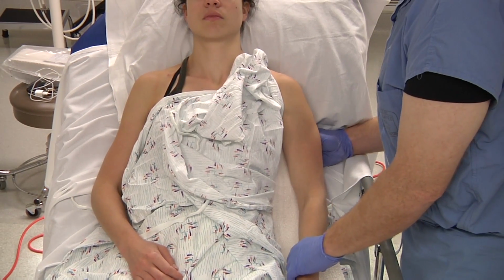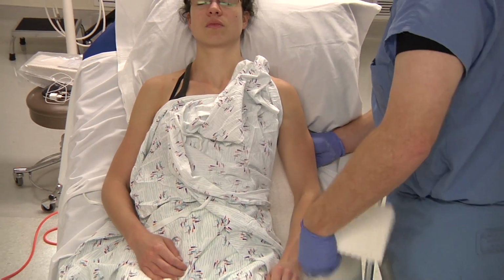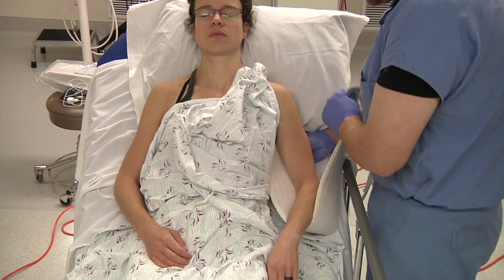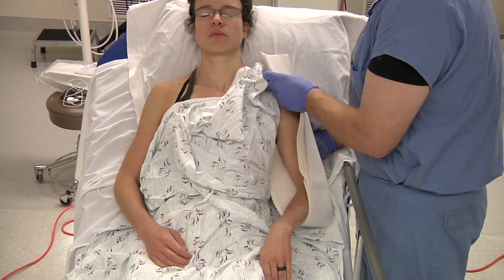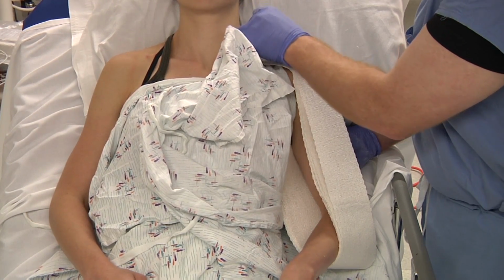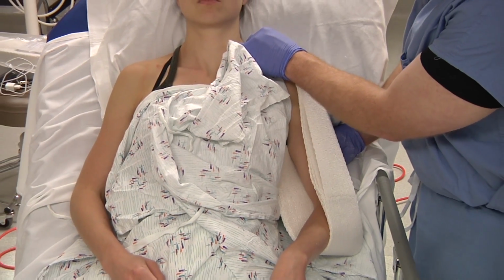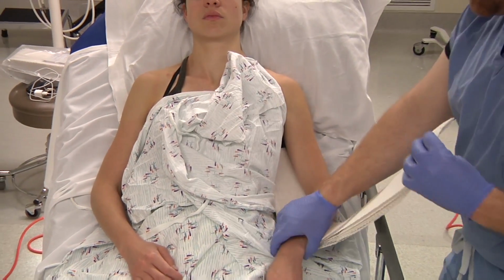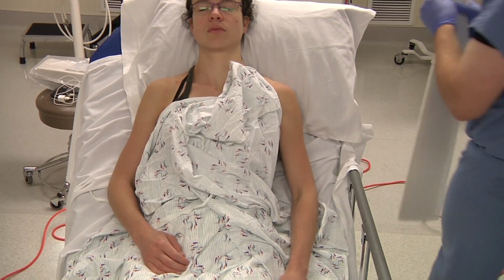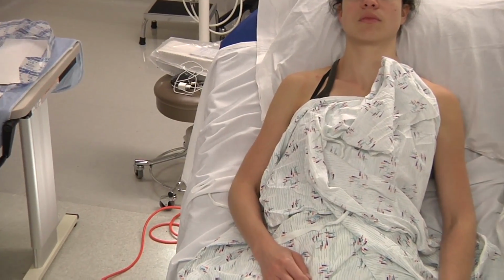pretty much as high as you can in the axilla, 3 finger breadths down. Splint generally wraps around the arm and it will come up to the neck. You can always turn it back, so this is about the appropriate length. We may take off an inch.